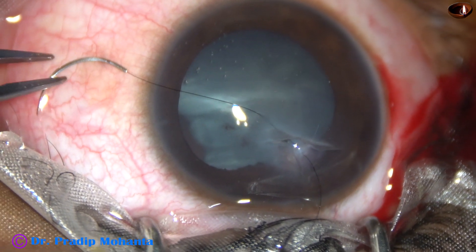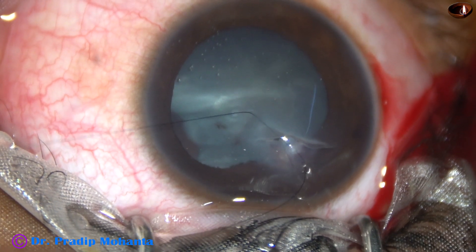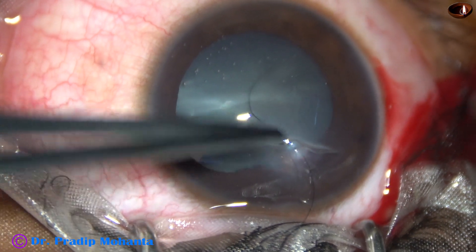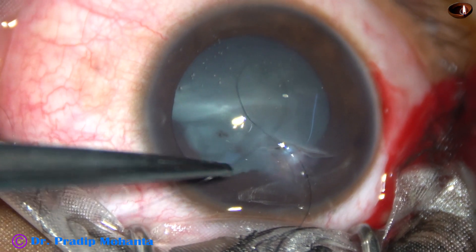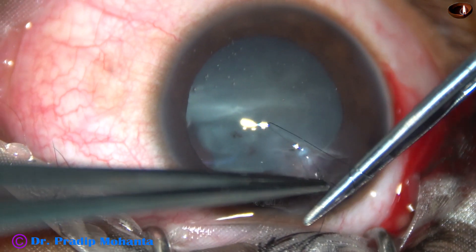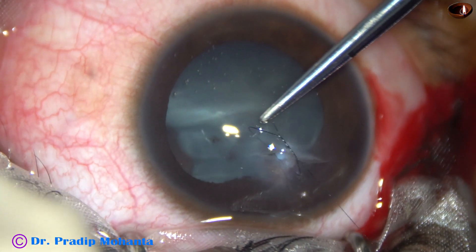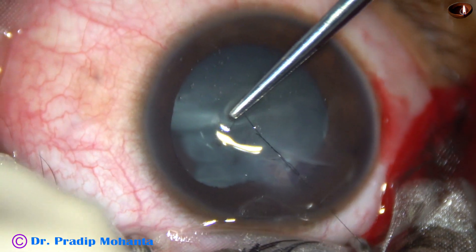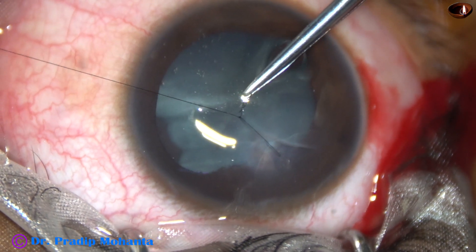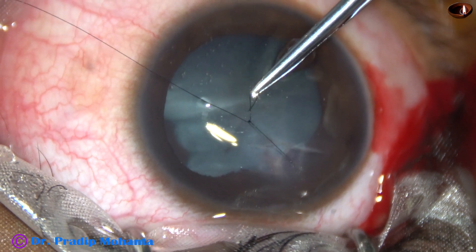The knot is 2-1-1: first two throws, then one more throw, and then one more. Both threads are pulled towards 5 o'clock in this case and the knot is temporarily locked.